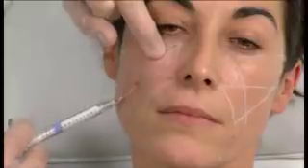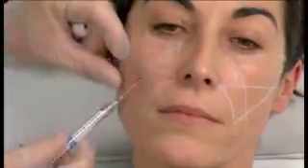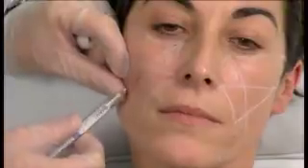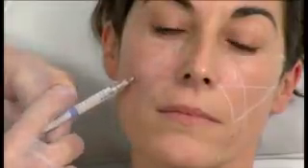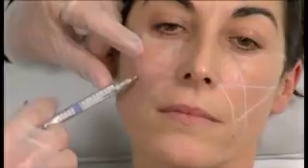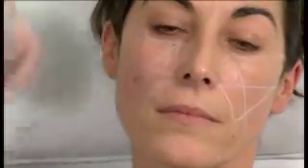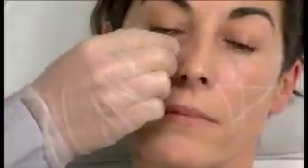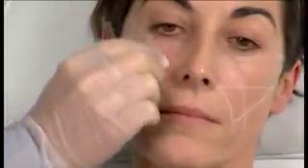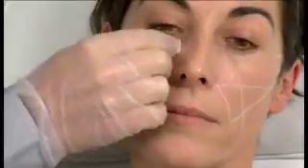Now, Yanni, you're in the subcutis there, right? Yes. Okay, great. Along the lines of this question about a Radiesse training session, I think it's quite important to get as much training as possible, because you want to learn what not to do. Yanni started off showing us where not to inject on the epiperiosteal plane around that infraorbital nerve. There are other danger zones as well, particularly the angular artery, which runs just lateral to the nose there. You want to be very careful when you're injecting the nasolabial folds. I think the cannula would probably offer a safer way to treat that area, because it's not going to easily get into the vessels and create an occlusion.